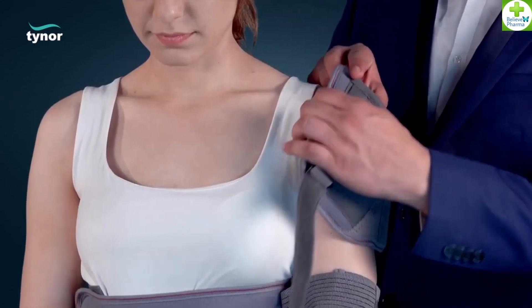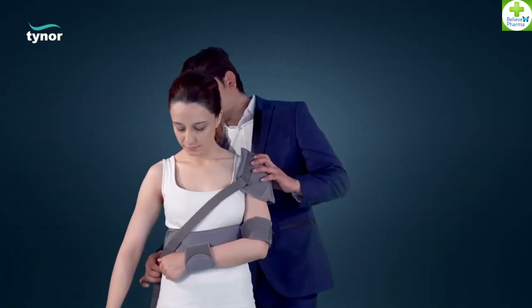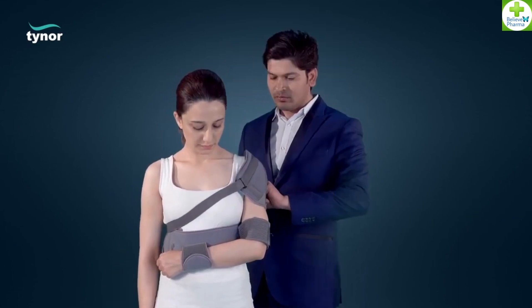Position shoulder cap on the affected shoulder. Fasten the hook loop closures.